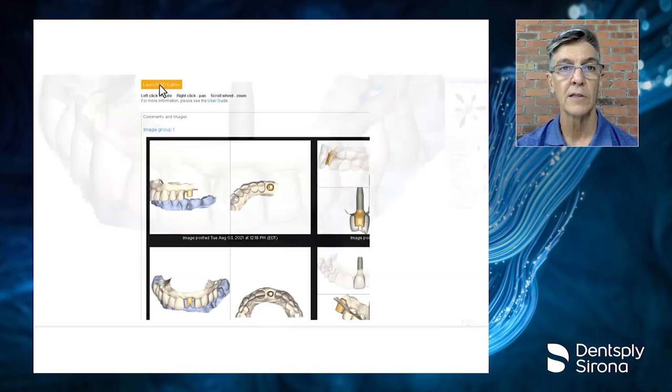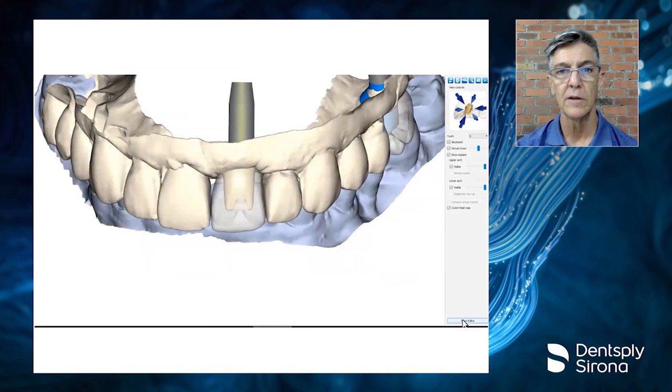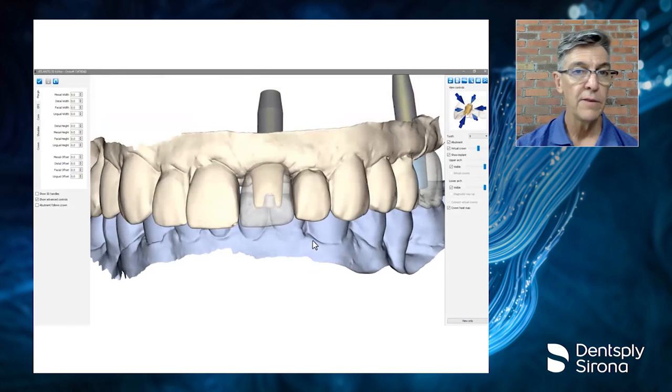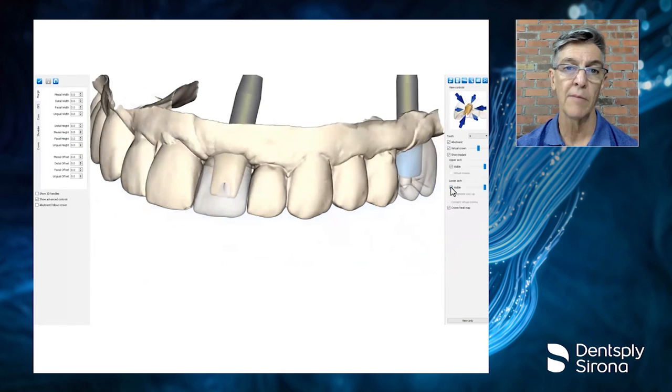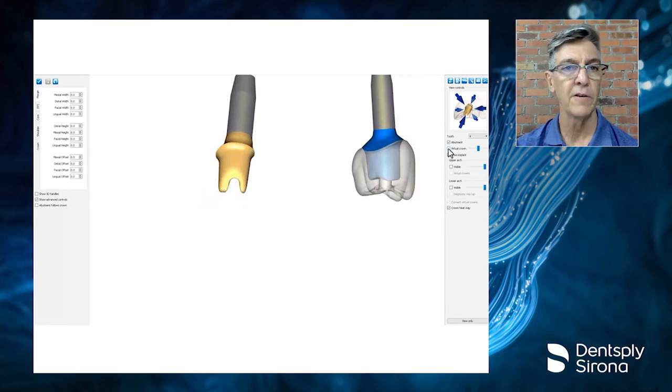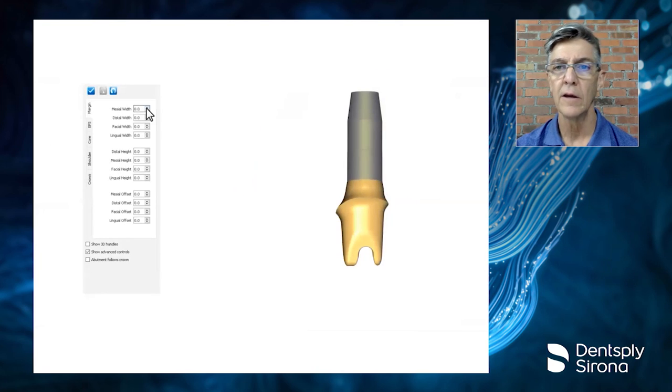The laboratory can then launch the 3D editor, go into the design phase, and from here, they can look at the opposing, they can look at the model, they can look at the abutment itself, they can alter the opacity of the images they're looking at. They can eliminate things they don't want at that moment, like the opposing or perhaps the actual model. They can look at how the crown is planned. That gives them an idea of how to plan the abutment. And then once they've got a feel for that, they can eliminate the crown. Anytime, you can reactivate the image and see what you want to see. And then from here, the laboratory can modify the abutment as they would like.